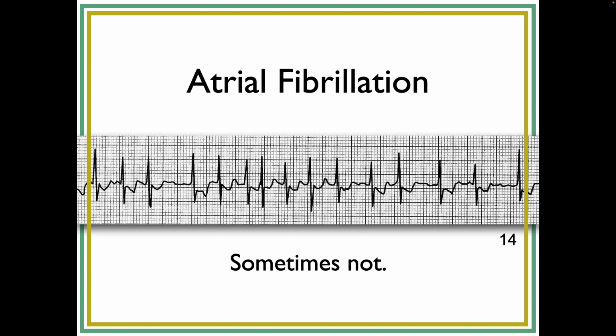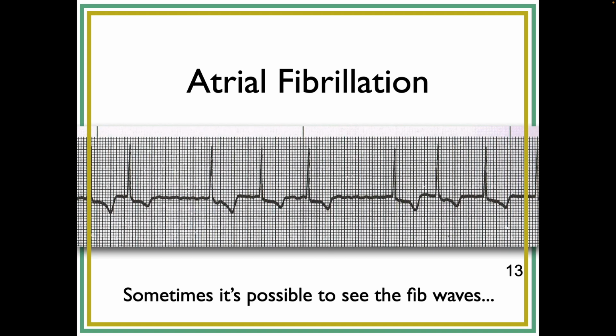Can you go back to the last slide? Sure. Quick, please? I missed what you were saying, the fib waves. Oh, it's really these shaky ones. Those are kind of classic fib waves. See how it's like that, okay? Here, you can see, that's the fib waves. What that is, is the chaotic depolarization in the atria.